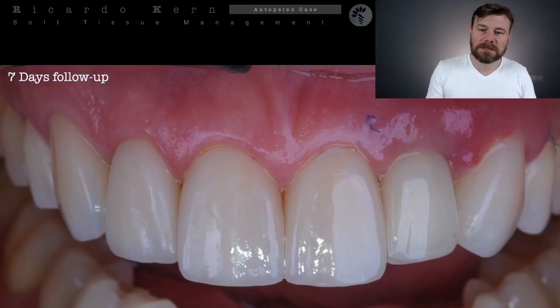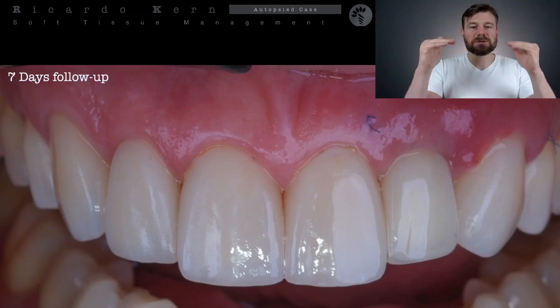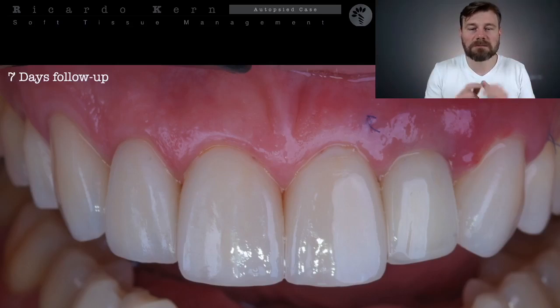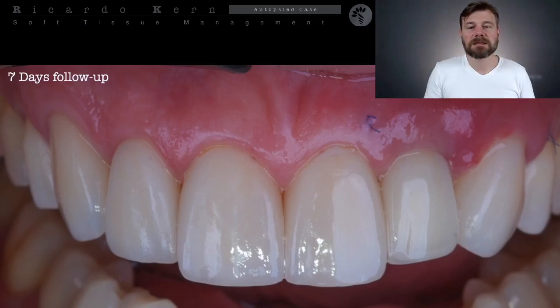After 3 months, the dentist can make a new crown for this patient and probably balance the cervical margin much better between one lateral and the other one. We create a little more excess of tissue, and now the dentist can make a small conditioning and position perfectly the zenith point for this graft.